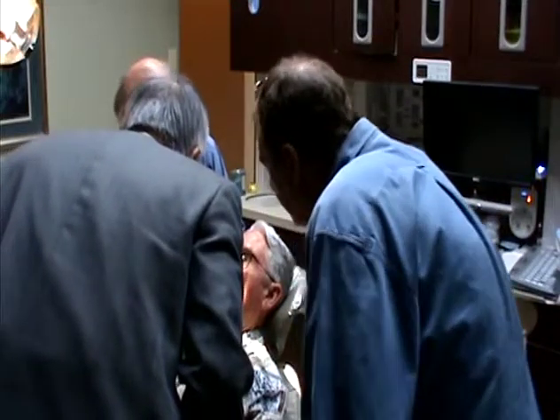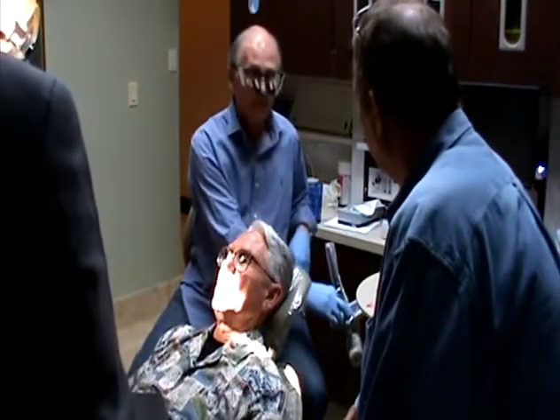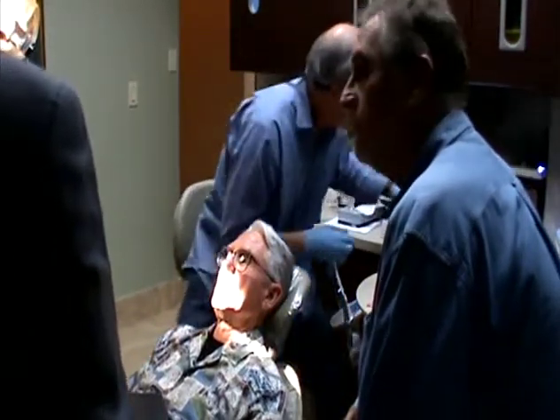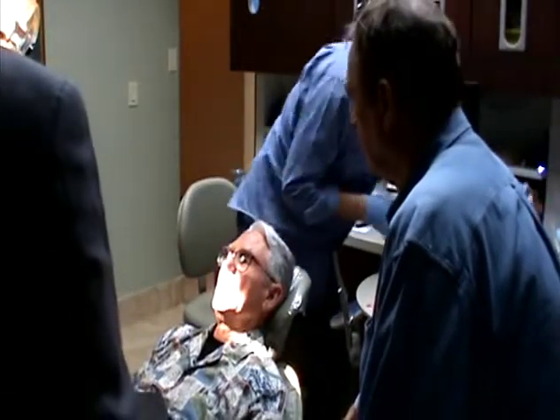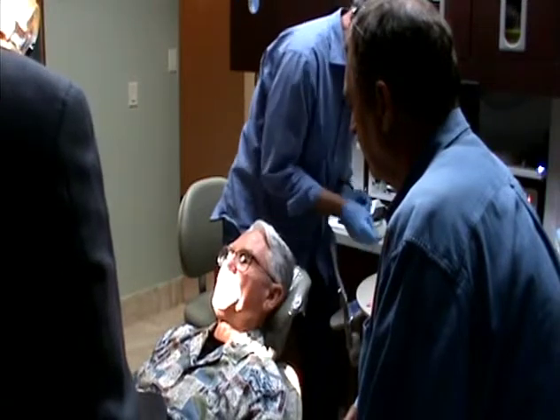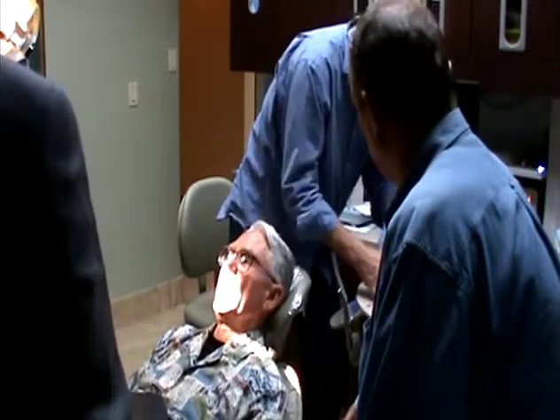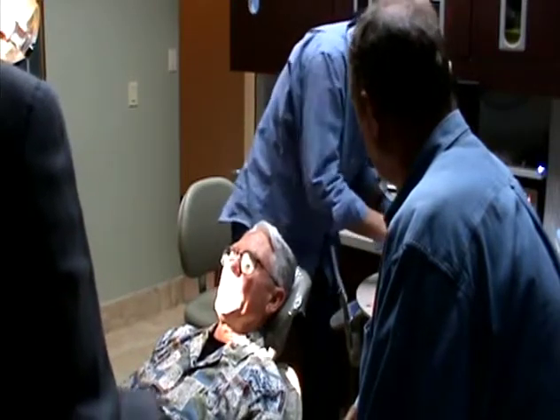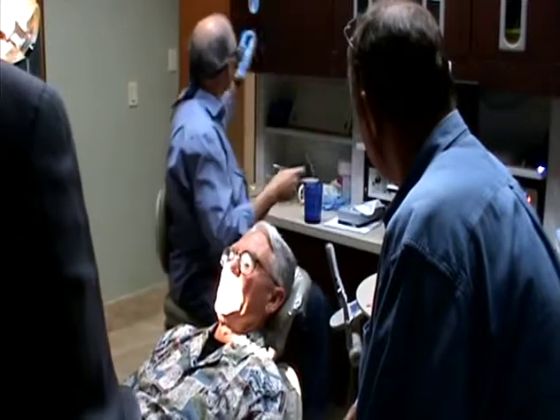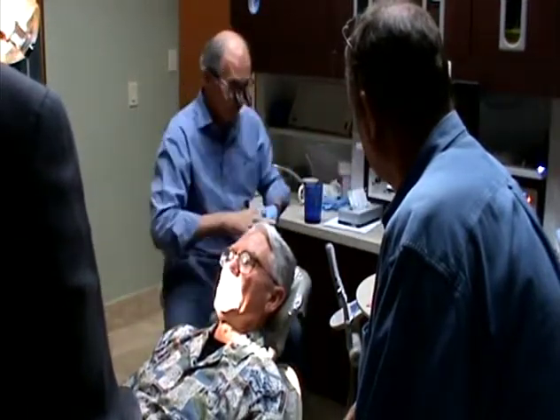I'm not saying any one place. He was kind of pointing between the first molar and the bicuspid. Bicuspid, yeah. But you don't find T-scan in this situation useful? I tried using it several times, and I didn't, for the time it took me to do it all. With a relaxed subject, knowing how to adjust occlusion, I get the same results, so I quit using it.